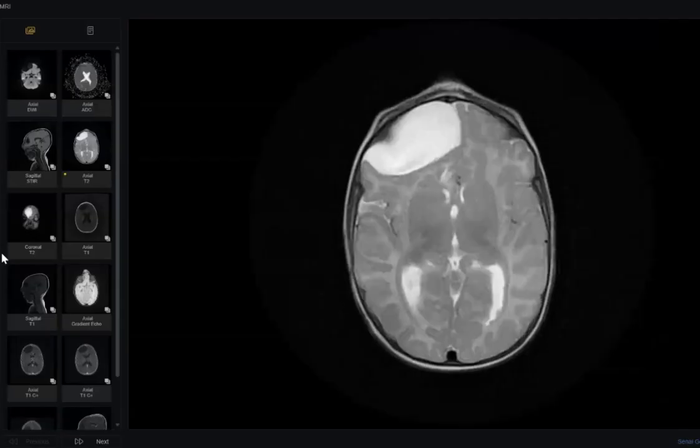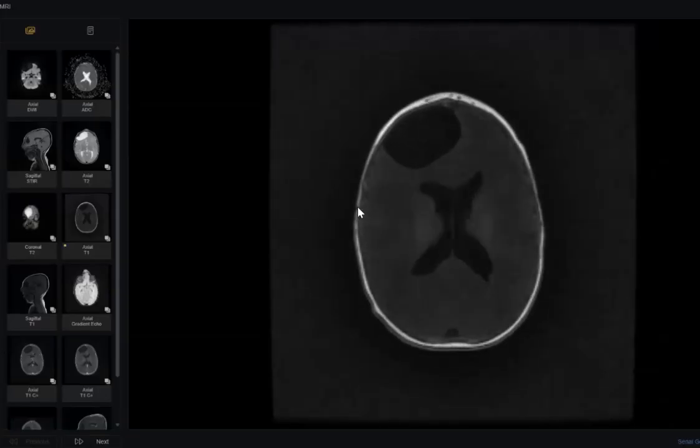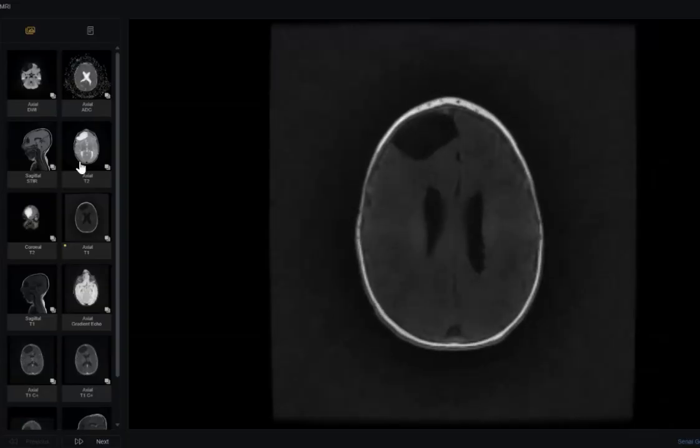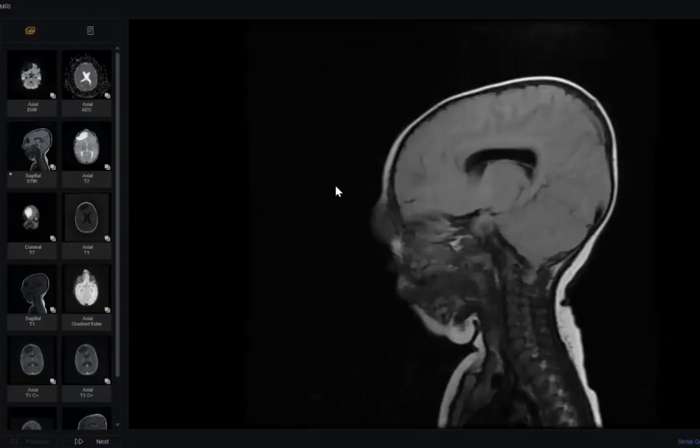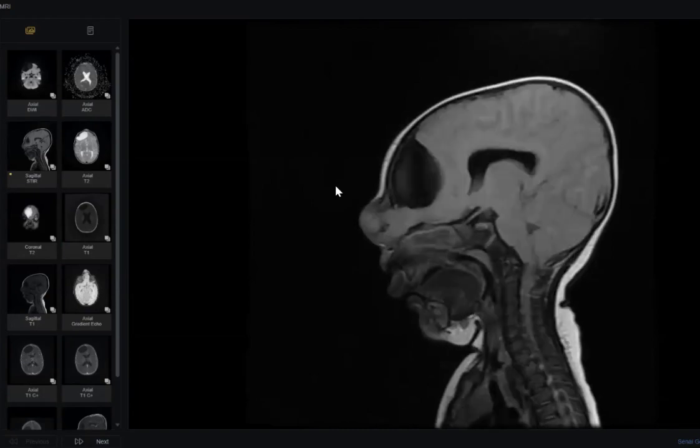So I will inform the findings to the referring physician, and also will suggest referral to pediatric neurosurgery, and also will reassure the parents. Thank you, doctor. Really, thank you so much. It was a case of satisfaction of search, but you got all the findings.